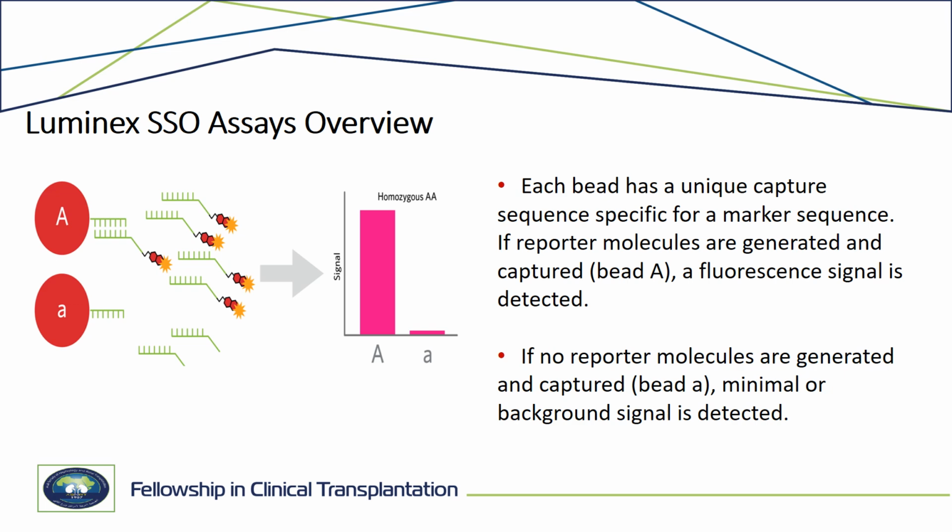When we do the assay, we combine the DNA from the individual whose HLA typing we want to determine with these beads. If the DNA is compatible with the sequence, the oligomer, present on these beads, it is going to bind. Then we add a fluorescent label that tags this binding, and if the fluorescence binds, it means that this patient is typed for the sequence present on these beads. So let's see an example of that.